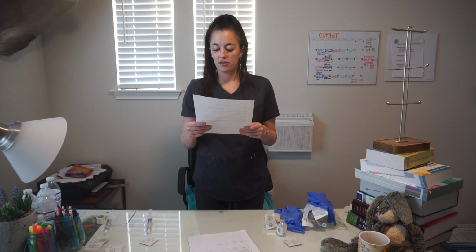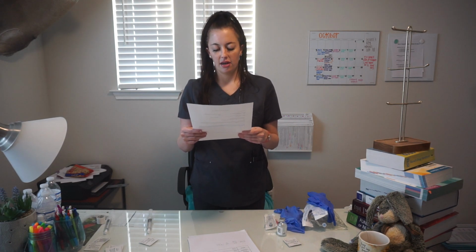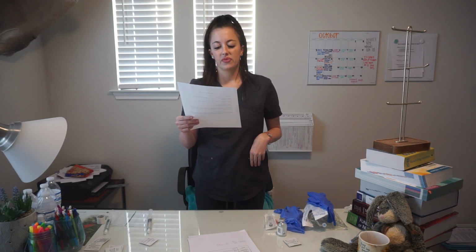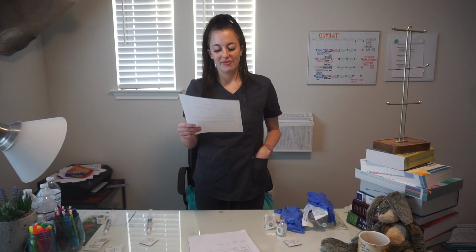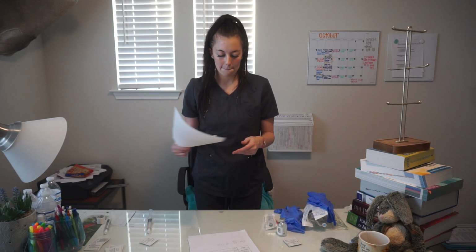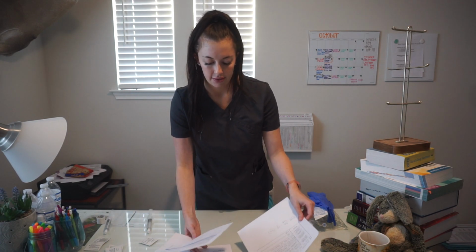My patient, Thomas Moore, is a 27-year-old male admitted with complications from an umbilical hernia. He has a PICC line that is saline locked. Vitals were just taken and his blood pressure reading was 182/86. The orders are to start D5 half normal saline IV at 100 milliliters per hour and labetalol 20 milligrams IV push PRN for blood pressure over 170/90, which is what he has. So we're going to go ahead and do that. He has no known drug allergies. Go ahead and get started.